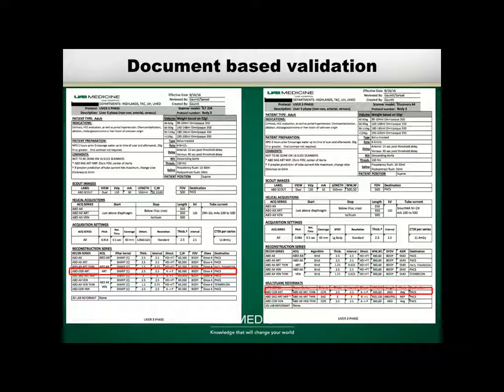We also notice that we have this whole new section down here called multiplane reformats. It's because, as I had talked about earlier, with the Philips ICT you build an MPR series off the acquisition. On the Discovery, you build an MPR series off an axial series, which was built off the acquisition. So we now have a column here that says which one of these recon series was built off one of those axial series.